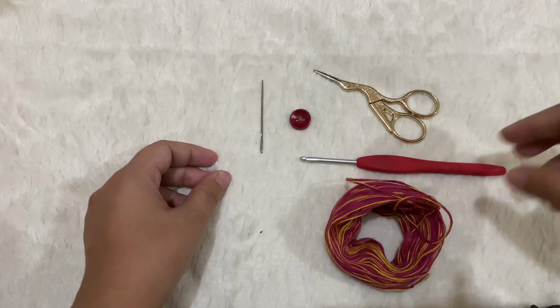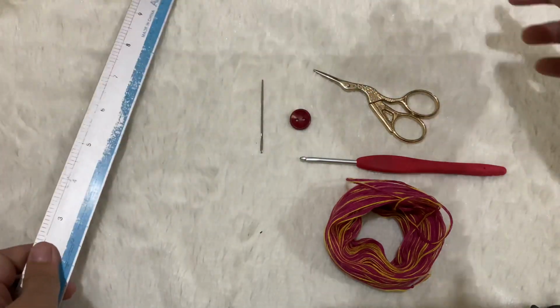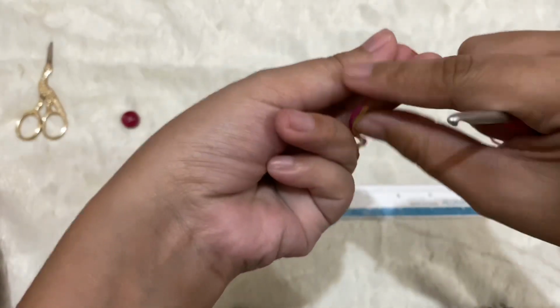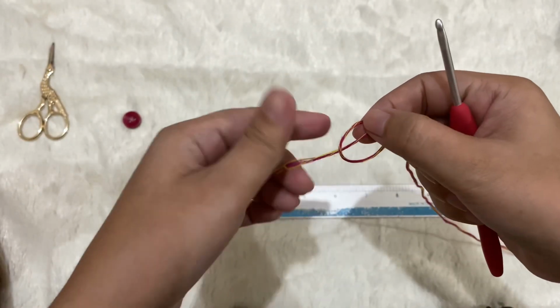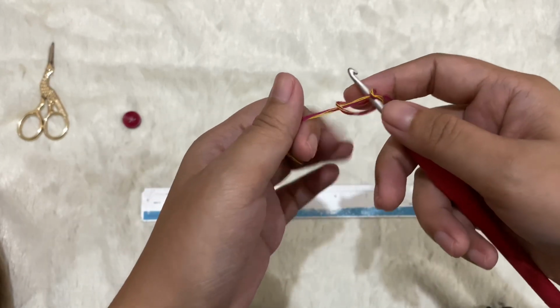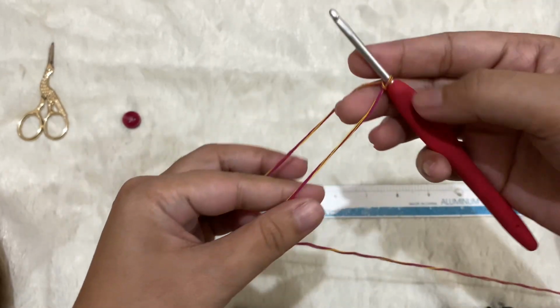So we need scissors, needle, your crochet hook, yarn, button, and a measuring tape or a ruler. Okay, so let's start with a slip knot. Okay, and you don't need to leave a really long tail. About 3 inches is enough.